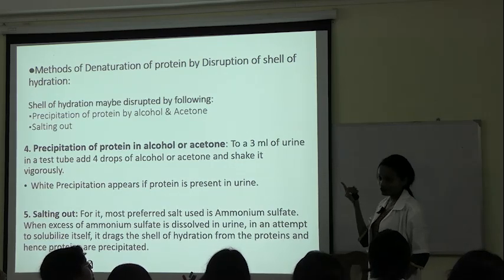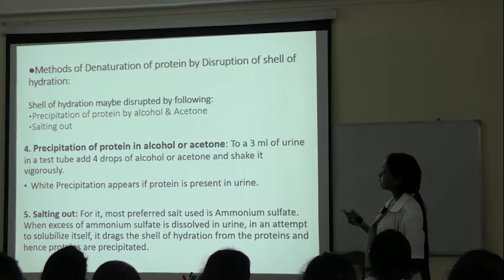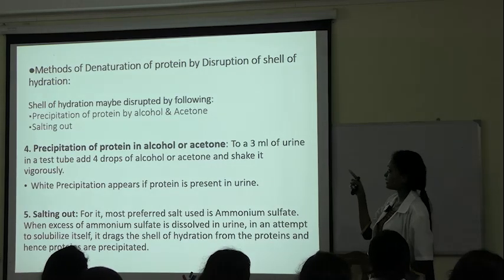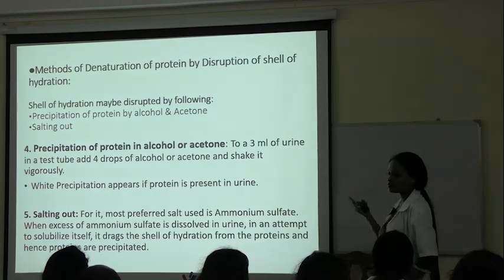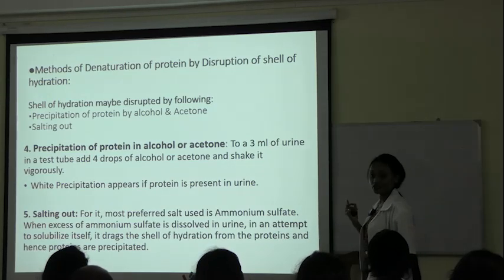The same fluid is this. So when we add alcohol, acetone or maybe salt, the hydration shell may be disrupted. Here we are using the ammonium sulfate salt.